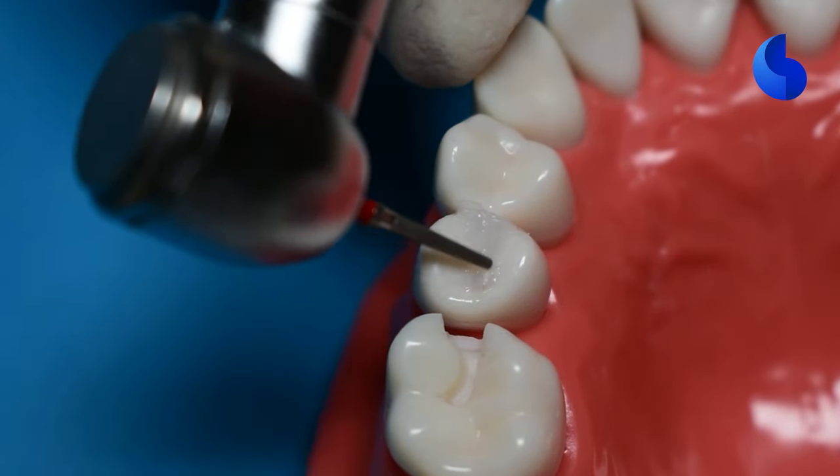Another great instrument to use, which I'm still trying to master, is a number 12 blade in a surgical blade handle. It's one-sided and it's curved, so you can take it to your interproximal area and just cut off that excess flash that's flowed onto your tooth structure. That's another way of removing the flash.